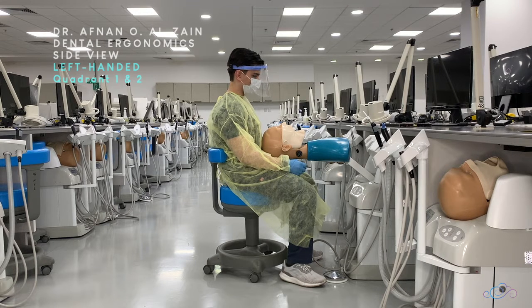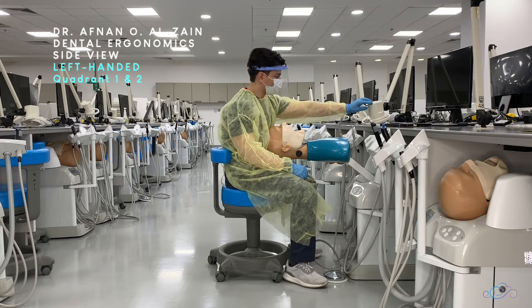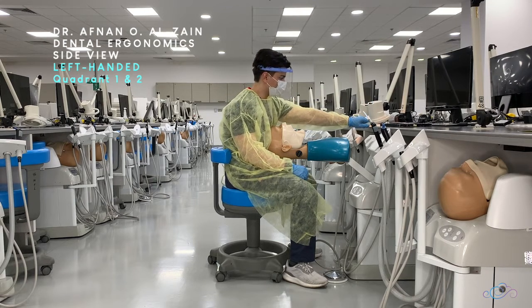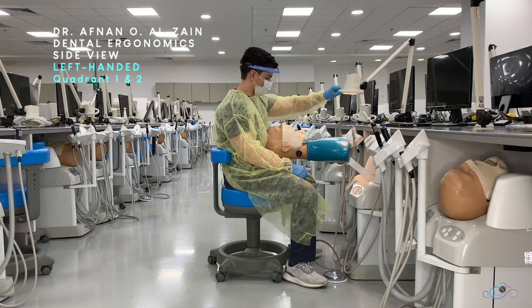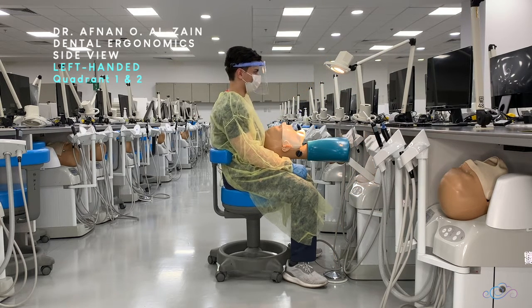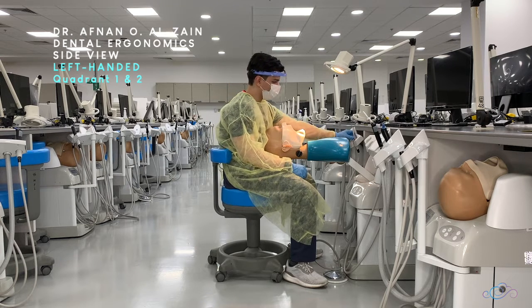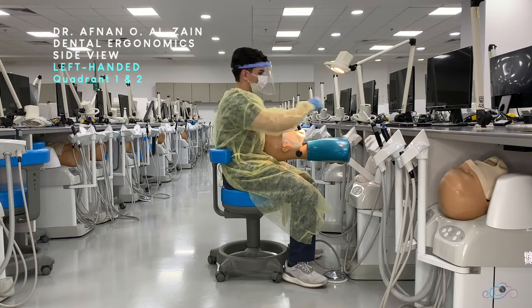When starting on quadrants one and two, you're going to place the patient in a supine position, allowing the level of the patient to be by your elbows, so your elbows will be by the corner of the mouth of the patient. Then you're going to move the light starting from the patient's chest towards the oral cavity so you do not disturb the patient and the light does not come on the patient's eyes.